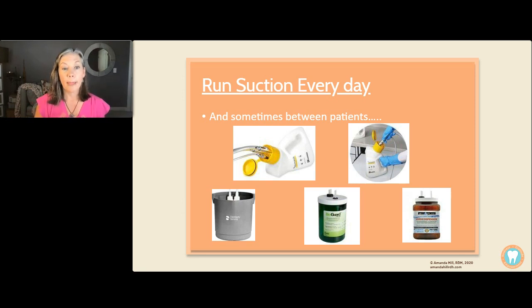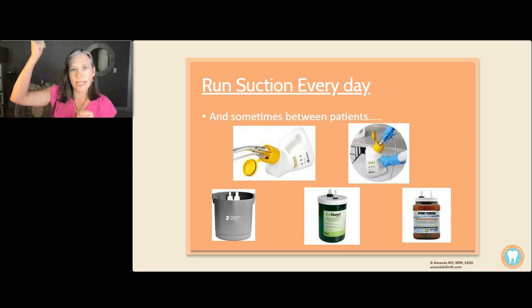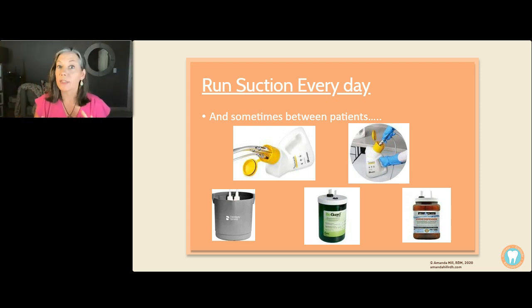I'm a big fan of using a dispenser, and the reason is that when I joined my current clinical office, I asked them, how do you guys do your suction? And they had an old gallon jug, and they were kind of doing the plunge and slurp, down and up and down and up. And really, that's super hard on your vacuum. It's not good for it. Like, if you ever learned how to drive stick, you know how your engine kind of sputtered back and forth, you're doing that to your vacuum. And vacuums are expensive, and they're getting harder to replace with all of our equipment shortage.